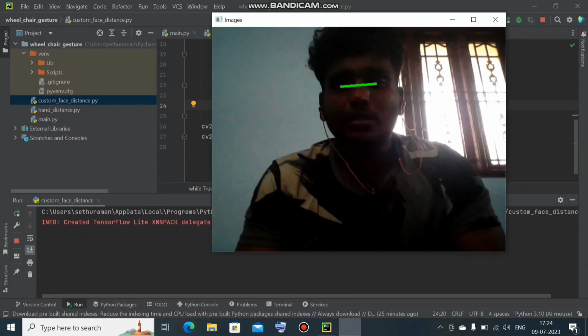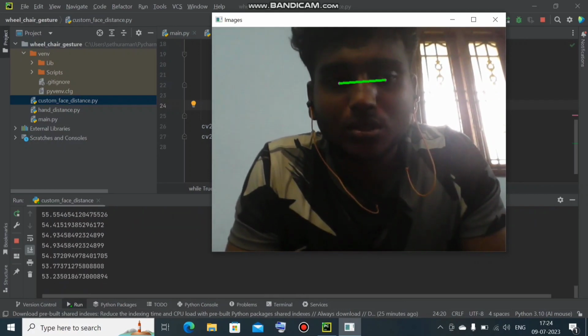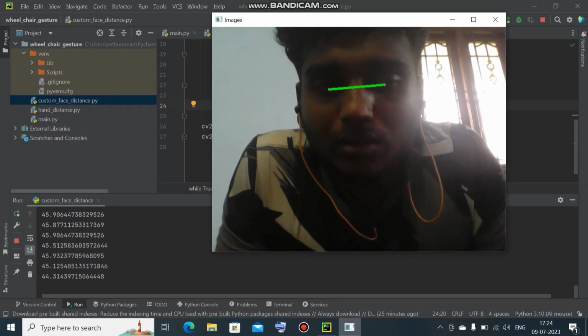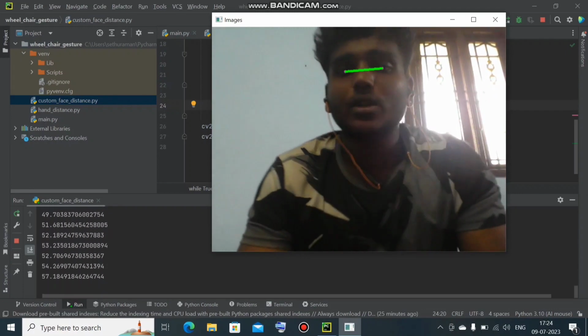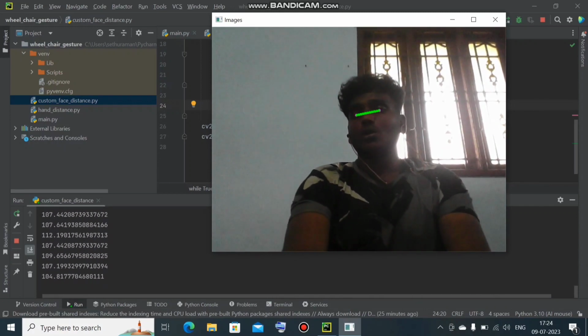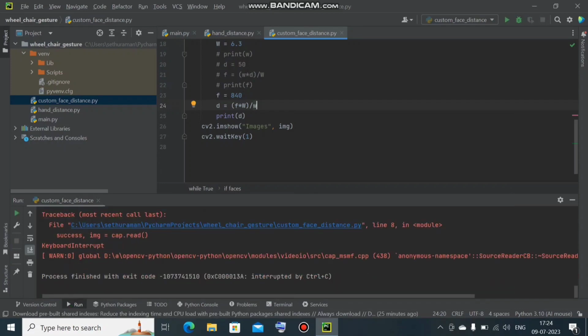It is running. So let us see, when I come closer to the camera, it is decreasing as we guessed, and when I go far from the camera, it is increasing. So now we will make it an integer. To make it an integer, you can add int.